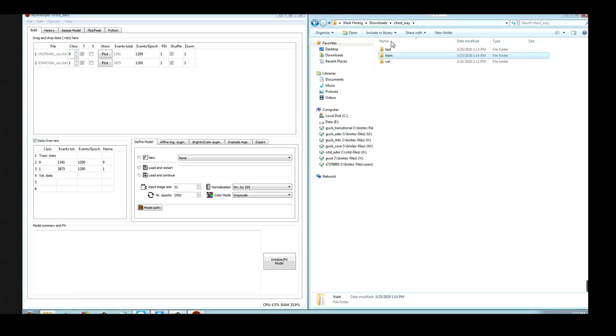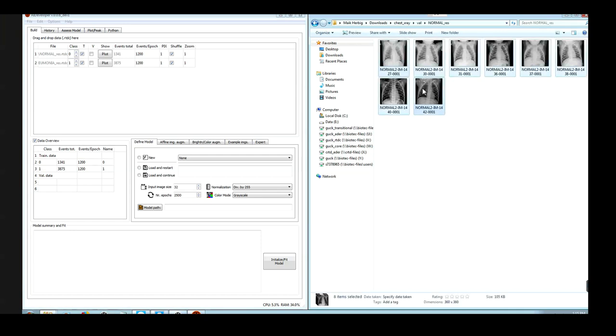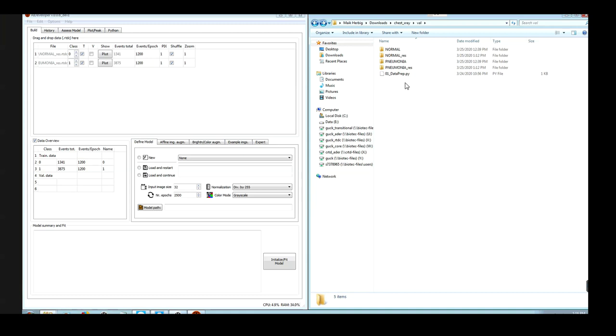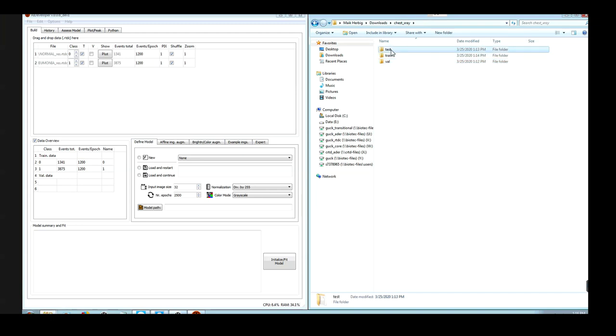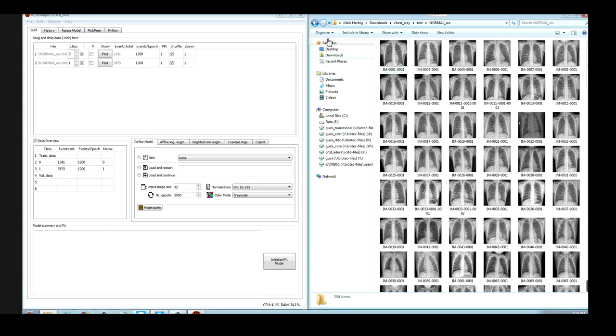Next we also want to insert a validation set. And when I had a look into the folder for the validation set, I figured out that it is very small. And if we think, let's say we have a validation set consisting of 10 images, in this case if our model does one mistake, we don't have an accuracy of 100% anymore but of 90%. In this case we would have an error for the determination of the validation accuracy of 10%. And in order to get a better tracking of the actual validation accuracy, I want to use this test set which contains more images.